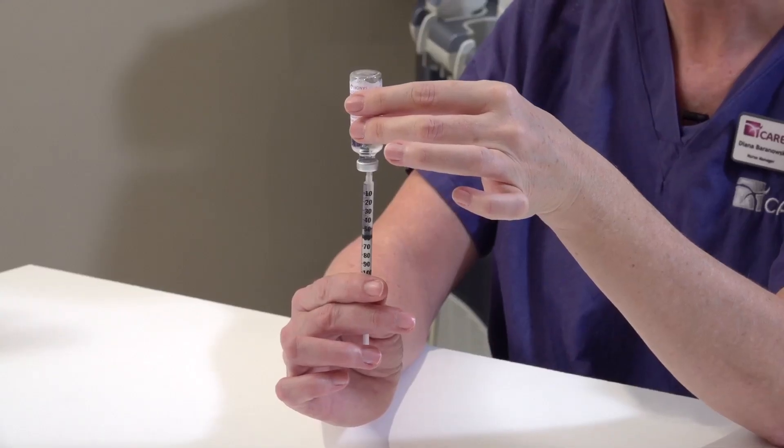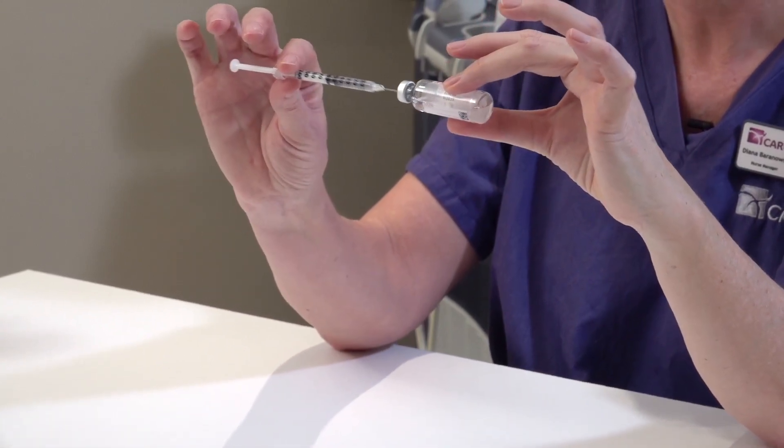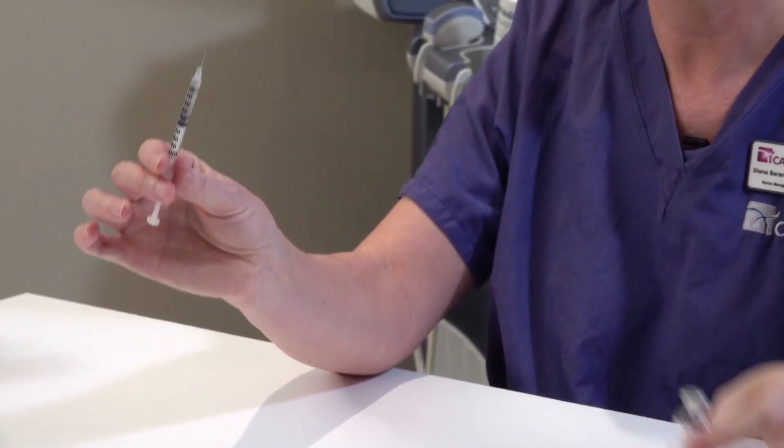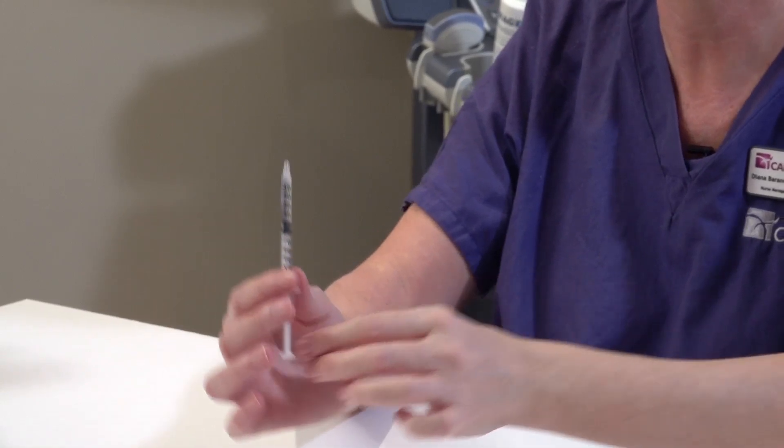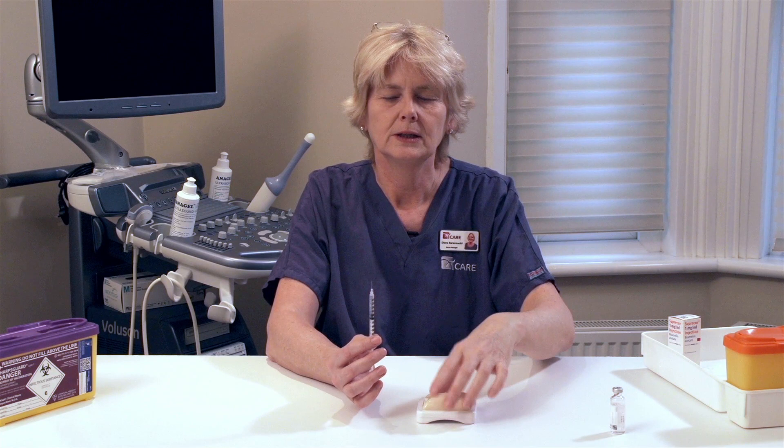Once you have the required dose in your syringe, you can remove the needle from the ampule. You are now ready to administer the medication. Suprecur is given by subcutaneous injection.